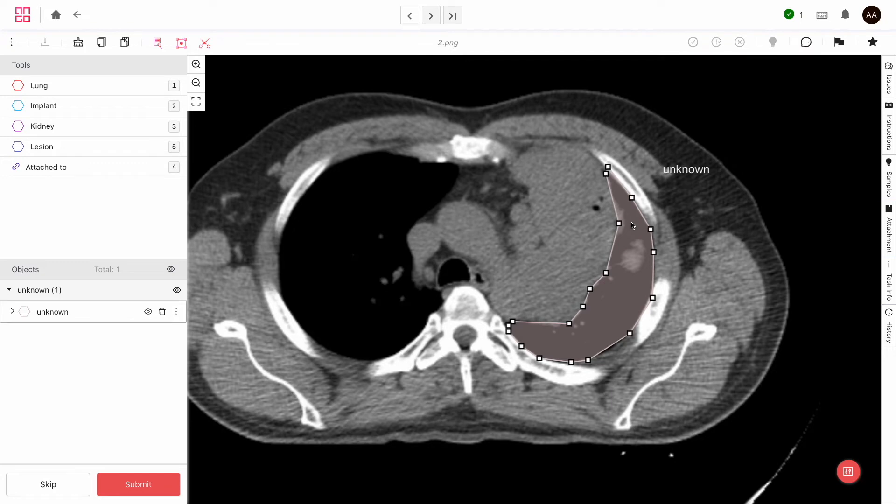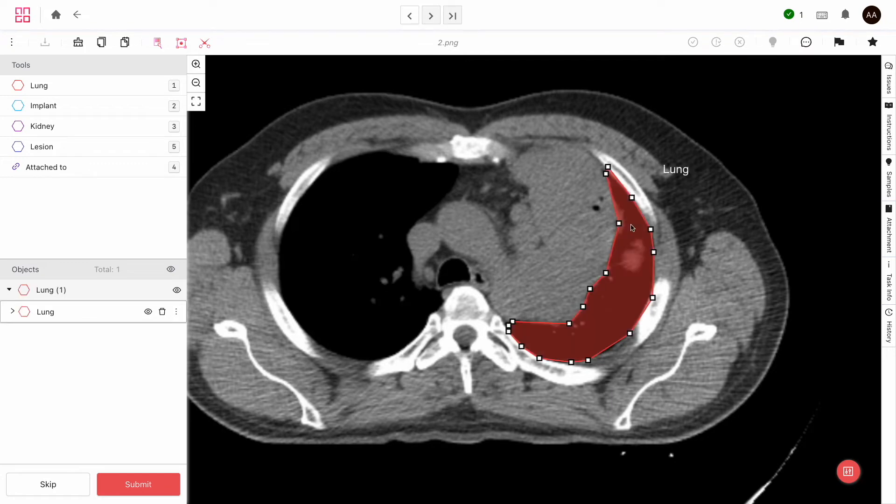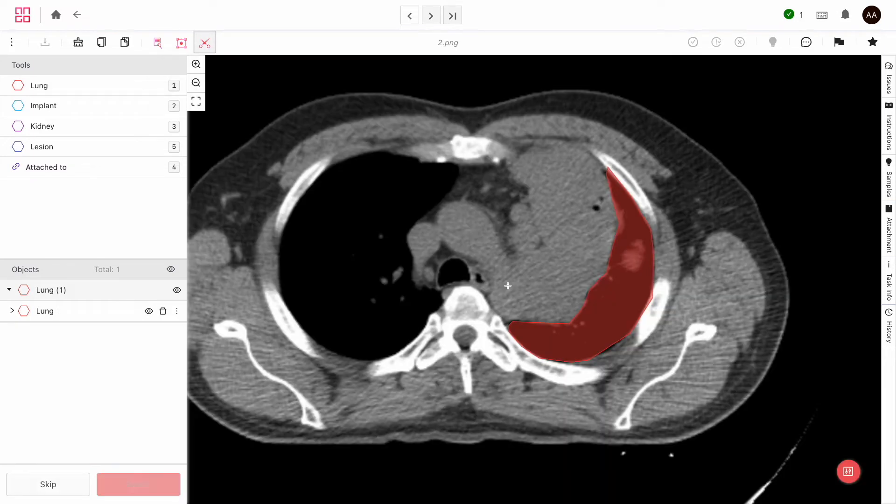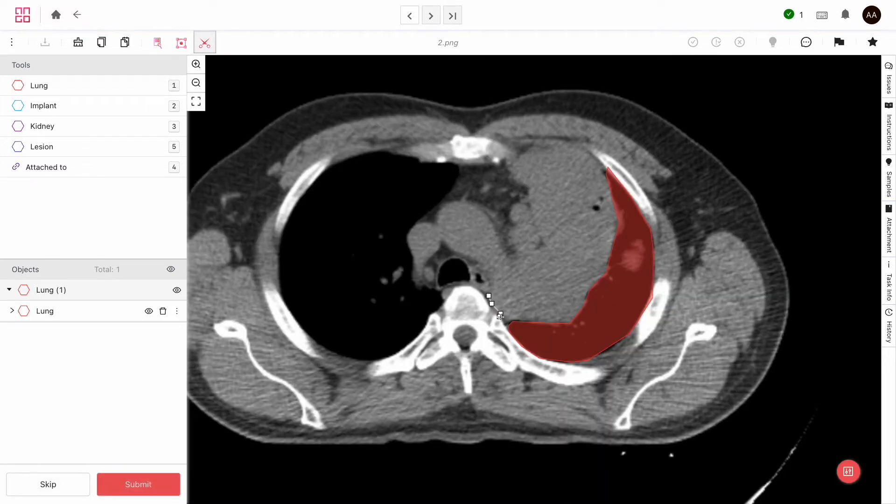It's a lung. So let's add this label to the lung category by pressing alt or options on the Mac and the number associated with the lung category.